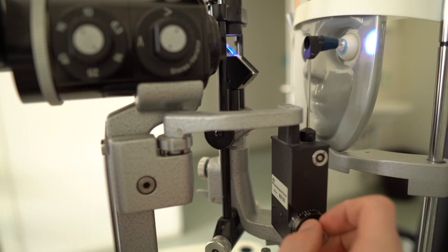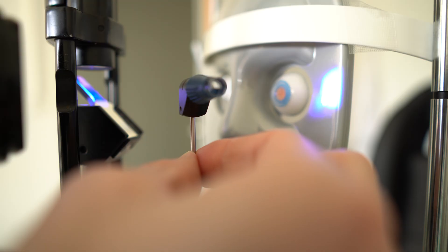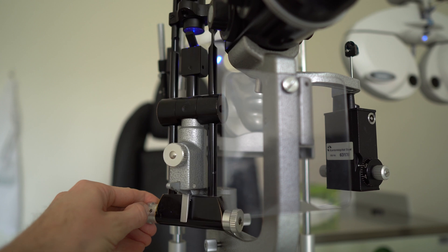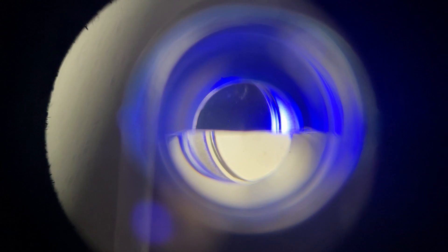Swing it forward until it locks in place, then make sure your measurement head is nice and straight. Switch your slit lamp to blue light and turn the brightness up as much as you can. Put it at about a 45-degree angle and then play with the light a bit until the measurement head is nicely illuminated.